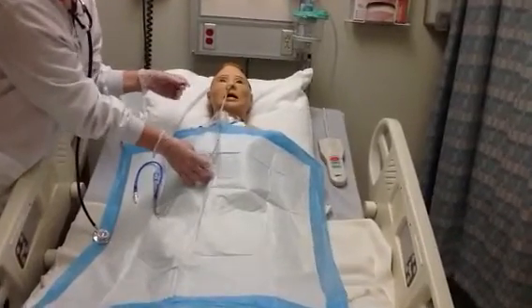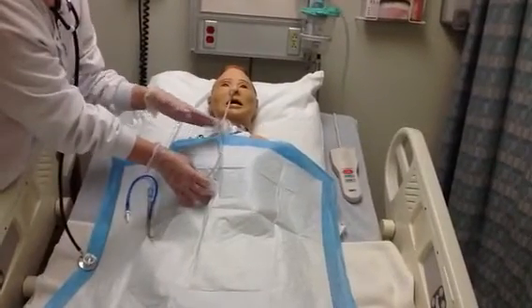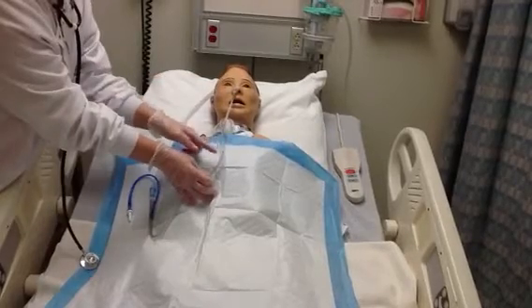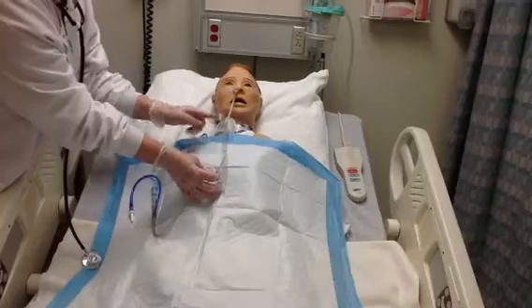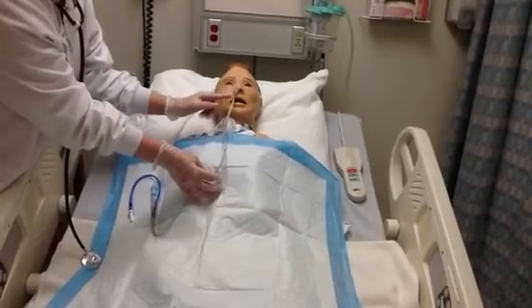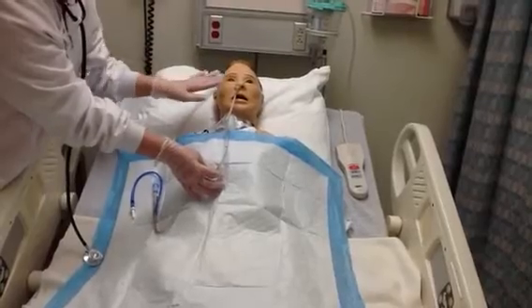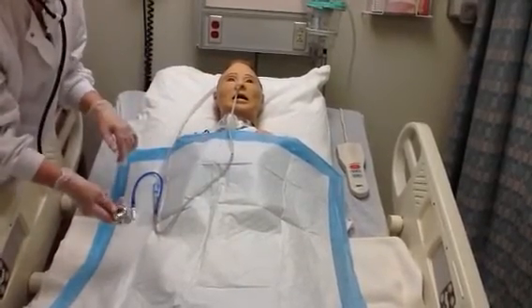When the nurse inserted the NG tube, he or she would have documented how many lines were on the NG tube outside of the body. So you want to make sure that you have the same amount of lines outside the body here. So this one is 3 lines outside of the nose, and that's what should have been documented upon insertion. So we're going to assess the skin for breakdown, the location of the NG tube.